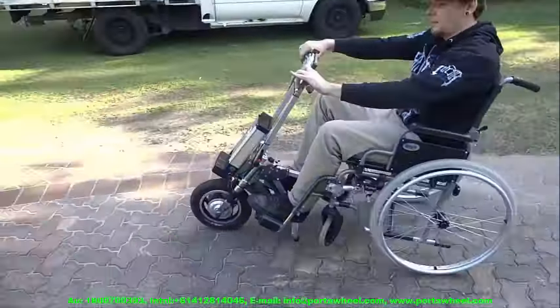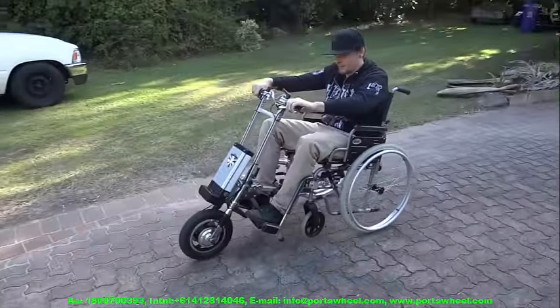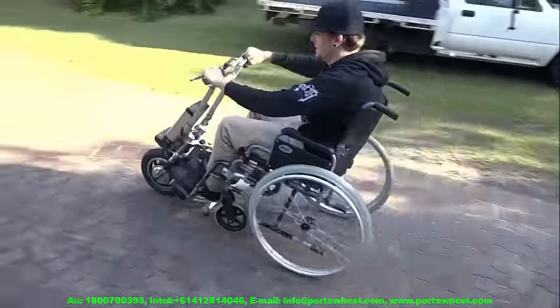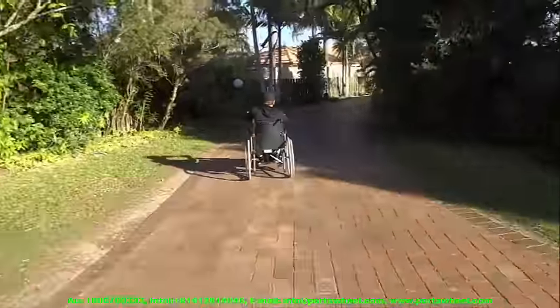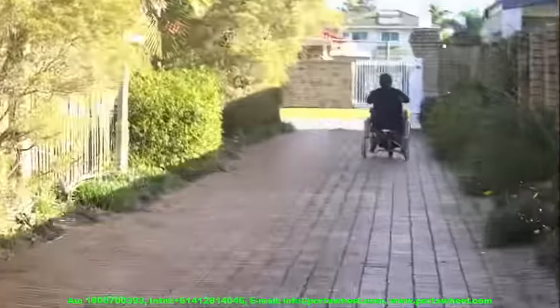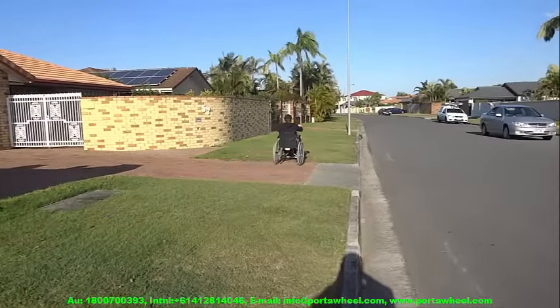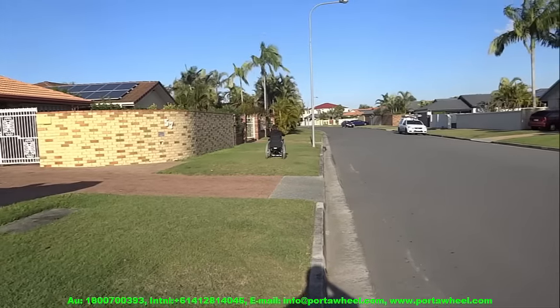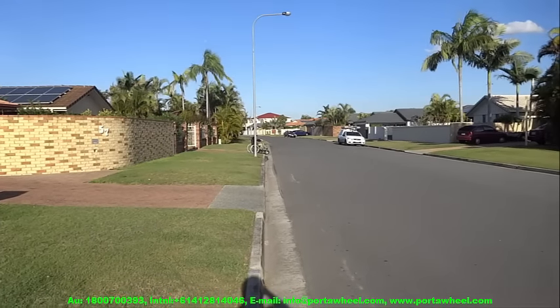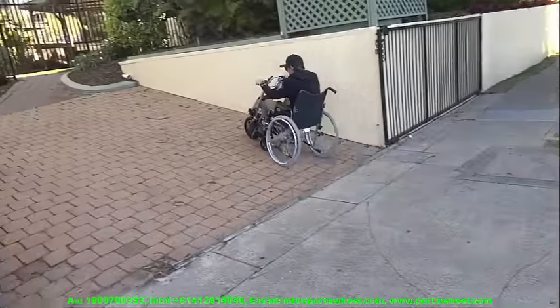Please check with your local city council about registration and third-party insurance requirements for your PortaWheel, as it may be classified as a mobility scooter. Before using it at high speed, have your auto mechanic check your wheelchair to ensure it is road-worthy at such speeds — most good brands will be fine. The PortaWheel ships with excellent disc brakes and a built-in torsion suspension system for a comfortable and safe ride, but your manual wheelchair was likely never designed for very high speeds.